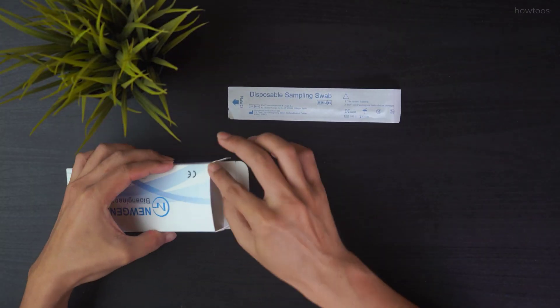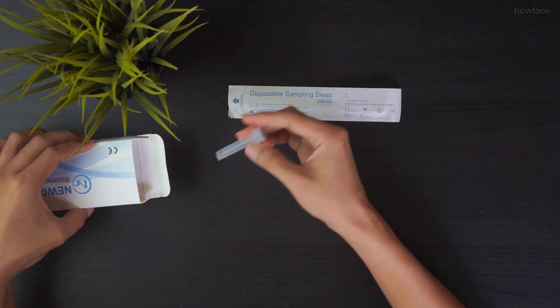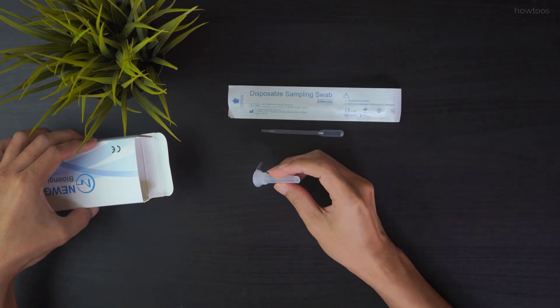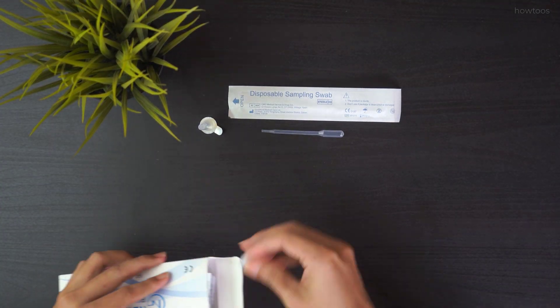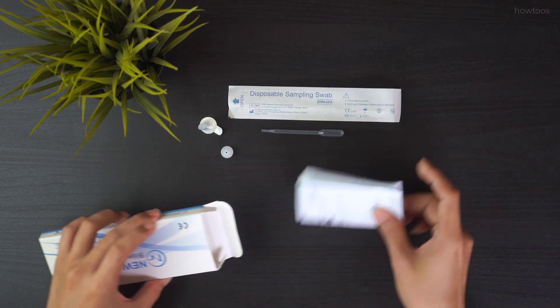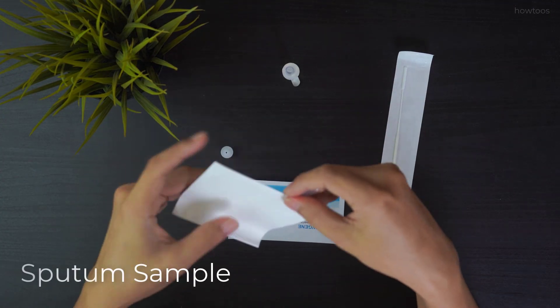You will receive a disposable swab, a dropper, a swab tube collector with reagent inside the tube, a cap to close the tube, a product manual, and a test card. For the saliva test you will need to collect sputum samples onto the small bag.